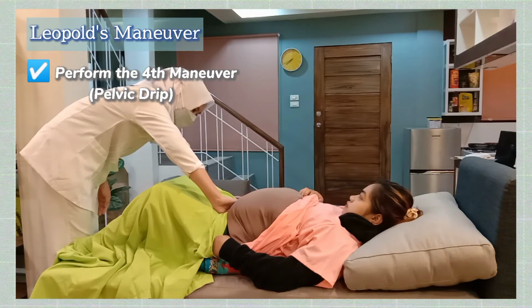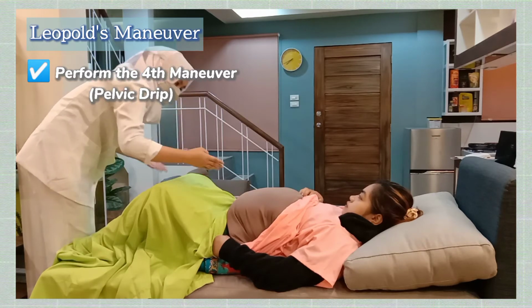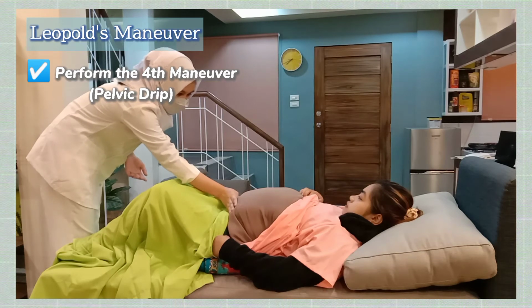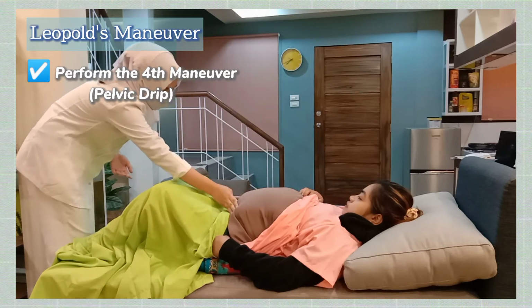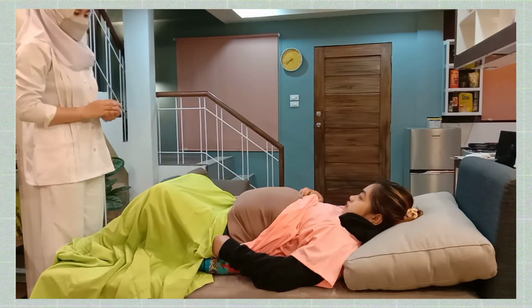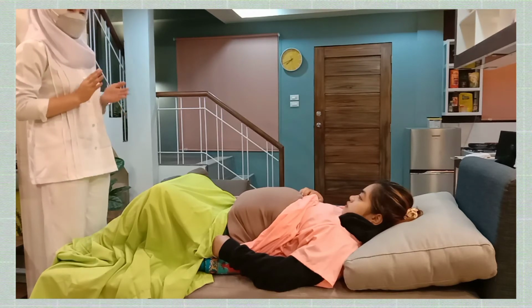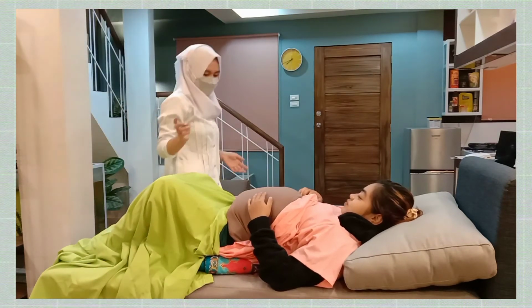Okay, ma'am, on this side, one of my fingers slides along the contour without obstruction. Therefore, it is the back of the neck of the baby po. While on the other side, one of my fingers meets with obstruction. Therefore, it is the brow of the baby. It means, ma'am, that the baby is in a good condition, attitude rather. Congratulations. We are done with the Leopold's maneuver.